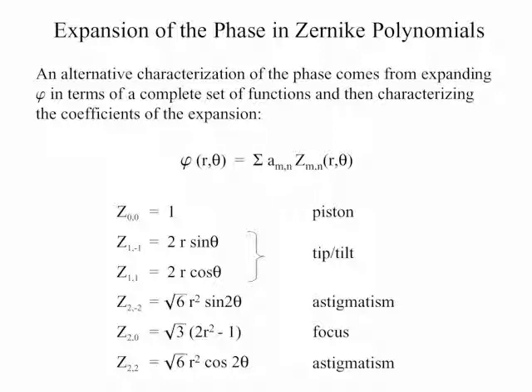What we're interested in is the degree of the Zernike polynomial, and it's given as the subscript on the Z, Z sub 1, Z sub 2, this sort of thing. And the Zernike polynomials have names to them too, clinical names that we're going to see.